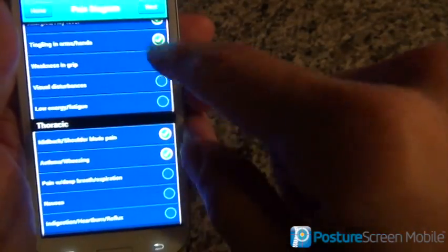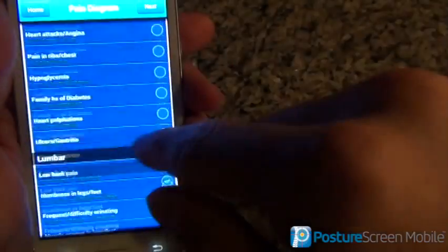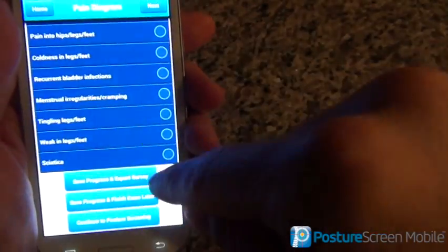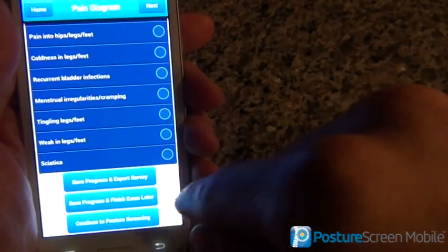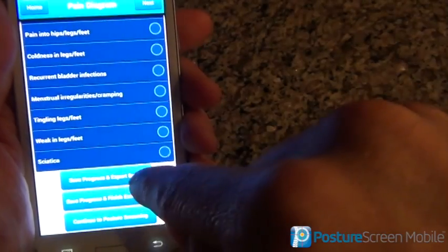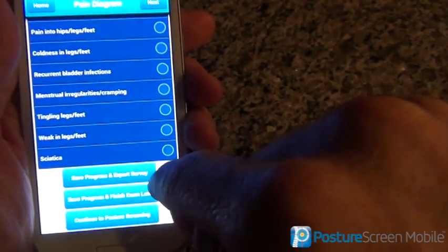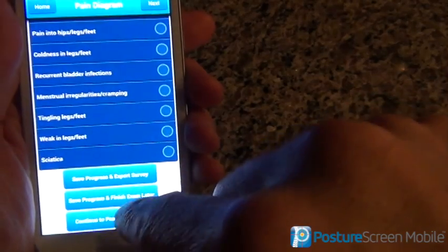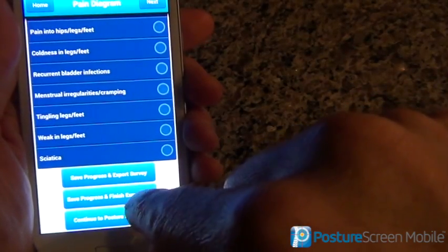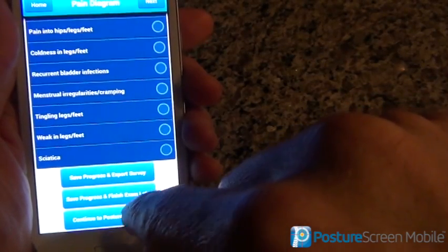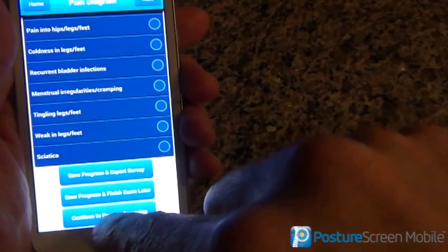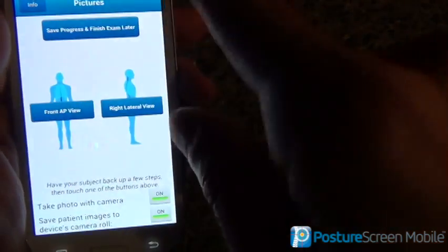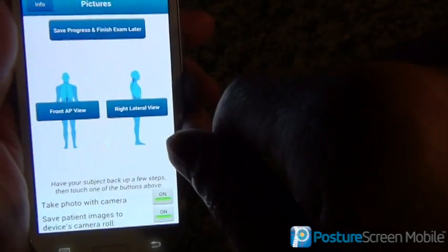When that's done, you can either hit next at the top or scroll all the way down. At this point, we can save and just export what we have, or we can save and finish later if we're busy, or just continue on to the next screening.